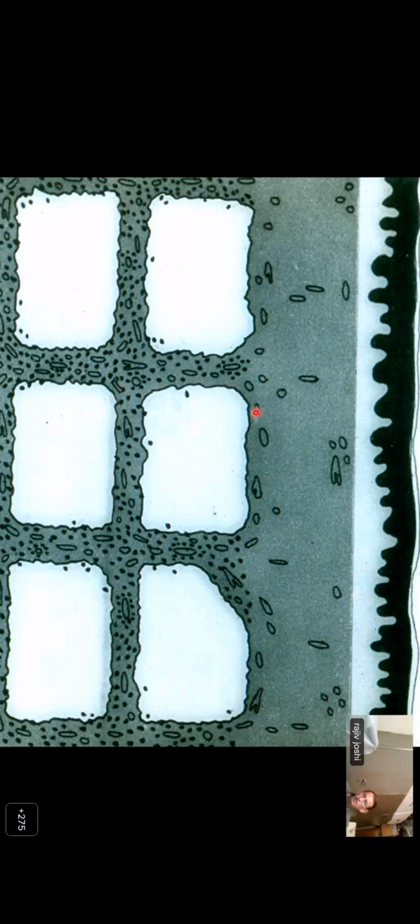One is the septal panniculitis, that is the fat lobules themselves are spared, but the main damage or the main effect is seen in the subcutaneous fat septae, fibrous septae. The prototype of this is erythema nodosum. So if you see, by and large, the fat lobules are not affected, but the fibrous septae, which separate these lobules, are markedly thickened, edematous, and infiltrated. You can even get small collections of histiocytes and small granulomas here. So this is typical of septal panniculitis, which is seen as its prototype in erythema nodosum.